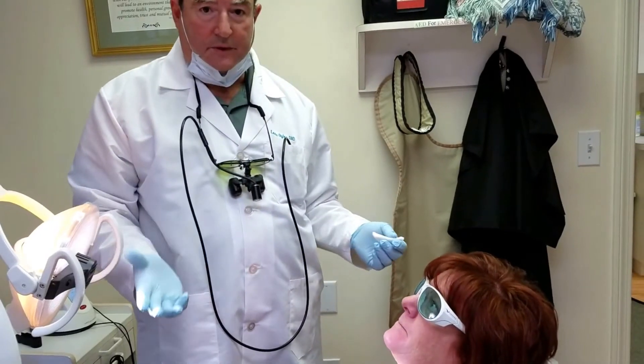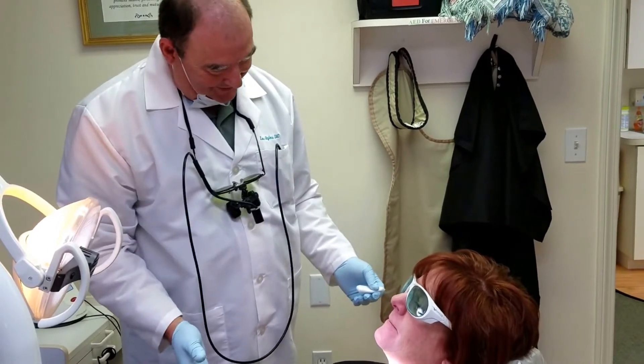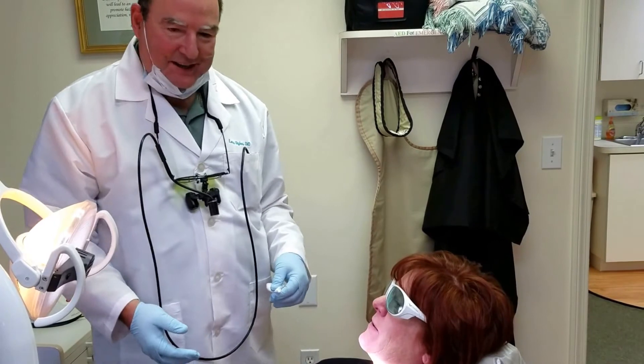What we're going to do here — a lot of people suffer from cold sores, and they are awful. They hurt. You can't even talk or anything like that. It hurts when you talk.